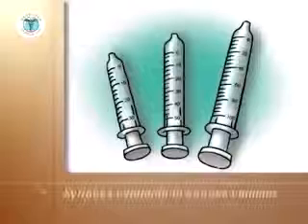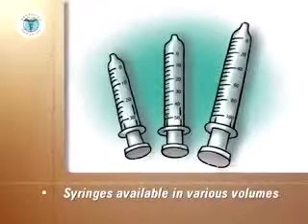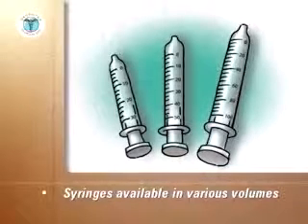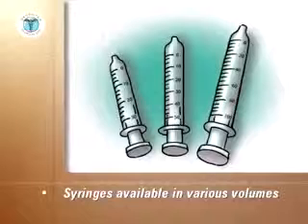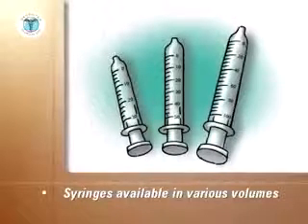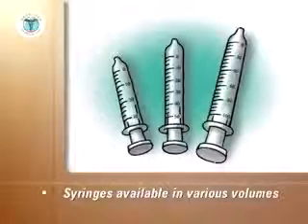Insulin syringes are available in various volumes. For example, 3/10 cc, which would hold a maximum dose of 30 units; 1/2 cc, to hold a maximum dose of 50 units; and 1 cc, to hold a maximum dose of 100 units.